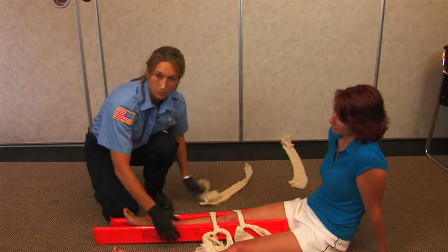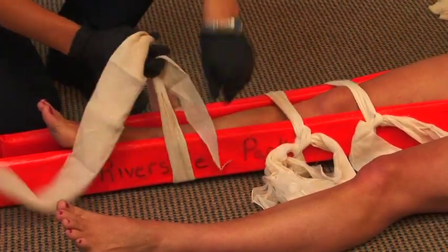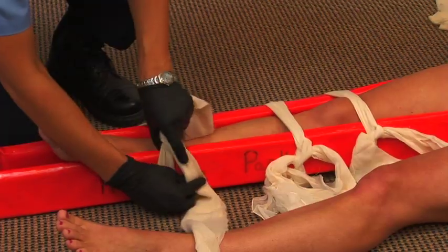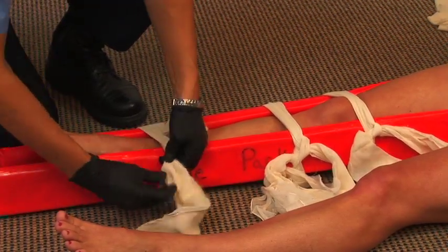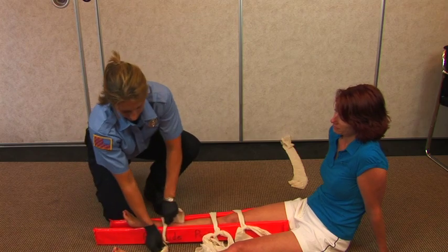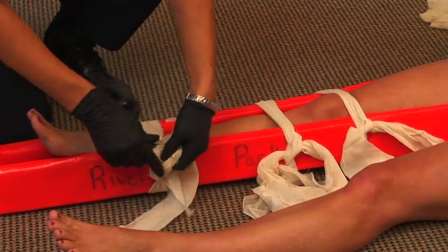Also place a cravat below the break. Do an overhand knot twice, and then do it the other way for a square knot.